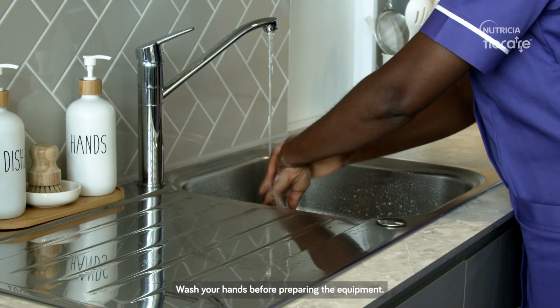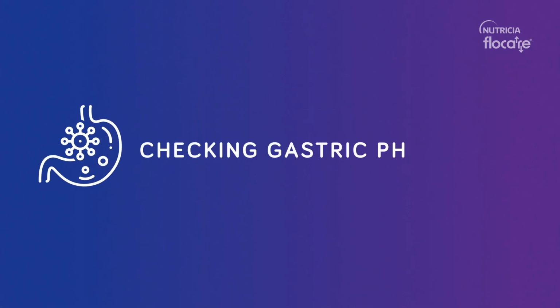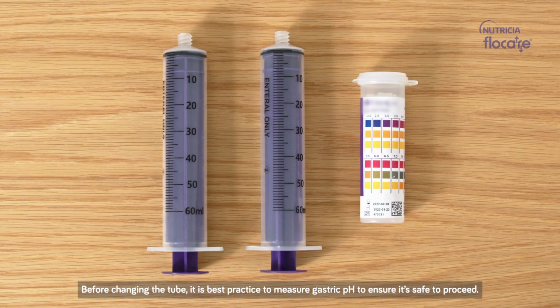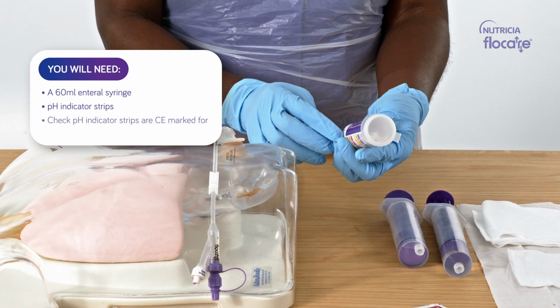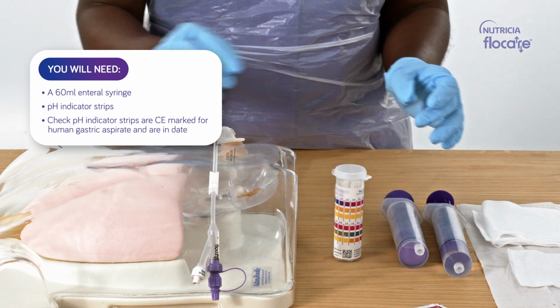Wash your hands before preparing the equipment. Checking gastric pH. Before changing the tube, it is best practice to measure gastric pH to ensure it's safe to proceed. You will need a 60 ml enteral syringe and pH indicator strips. Check that the pH indicator strips are CE marked for human gastric aspirate and are in date.